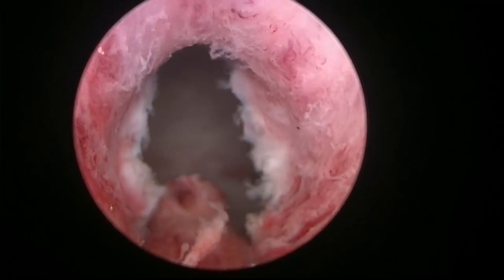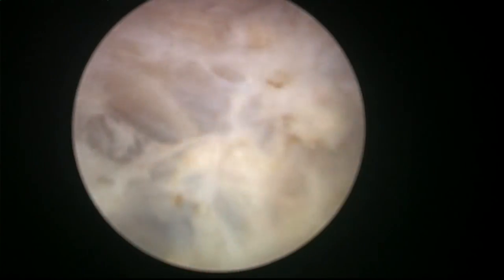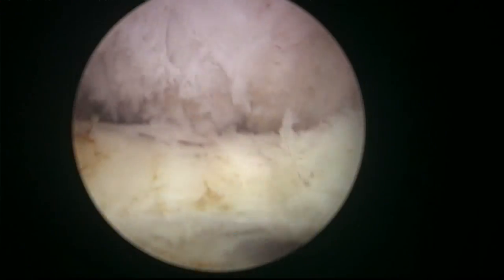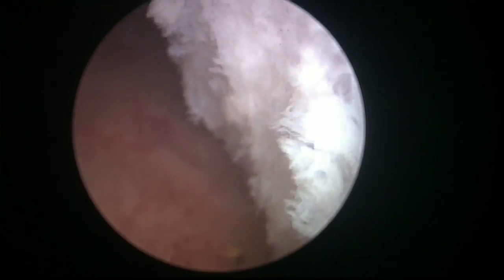That's the conclusion of the enucleation — you can see a very nice fossa. Look at the quality of the mucosa: the image on the right is what you want, the image on the left is what you don't want. This de-epithelialized sphincter result was seen with the classic three-lobe technique and was thought to explain the initial incidence of temporary stress incontinence, which could last several weeks. One possible mechanism was damage to the mucosa of the sphincter — you want to protect it. Now we're changing to the nephroscope for morcellation; my nurses are very well trained and we can do it fast.